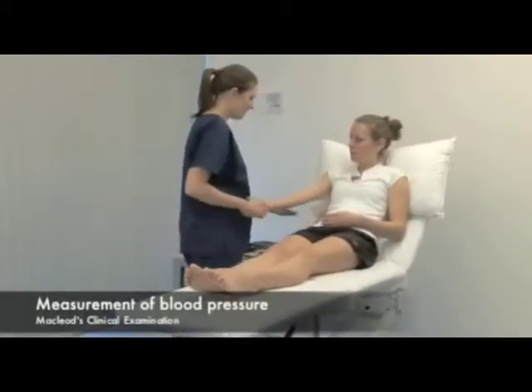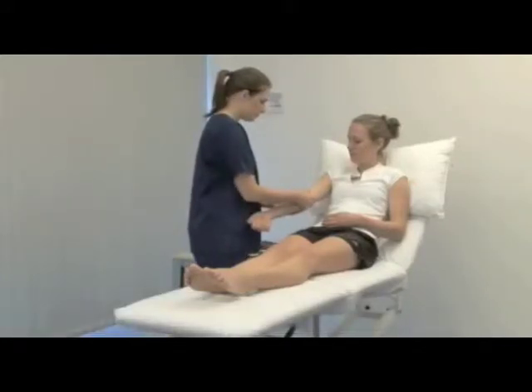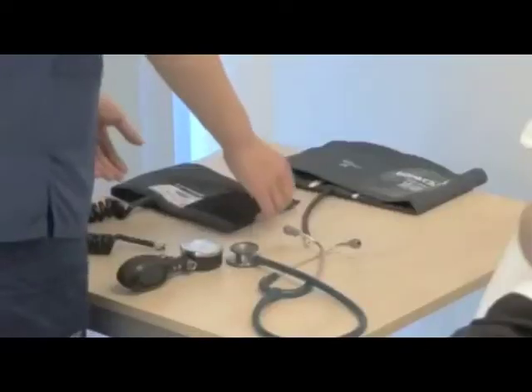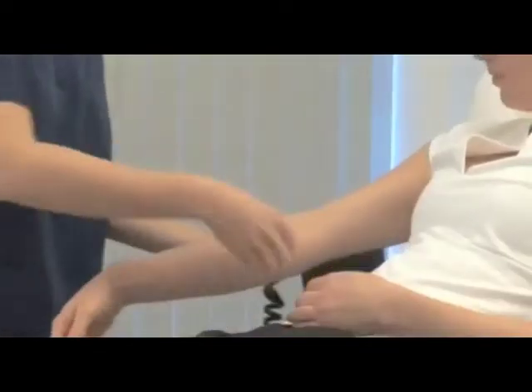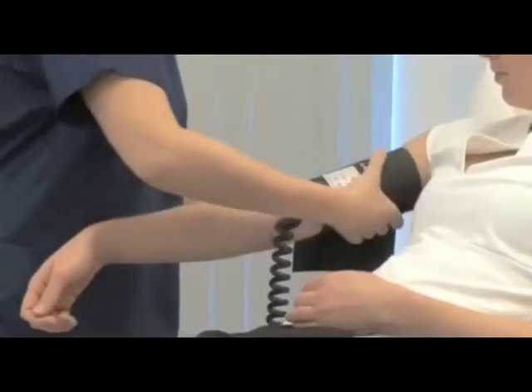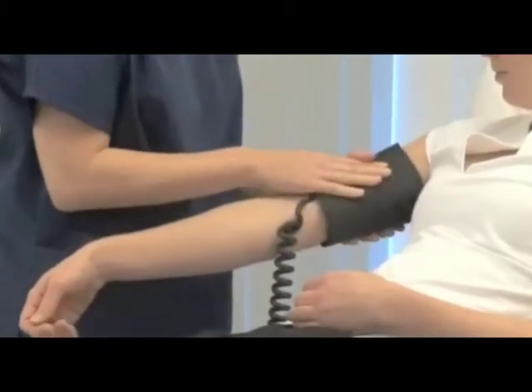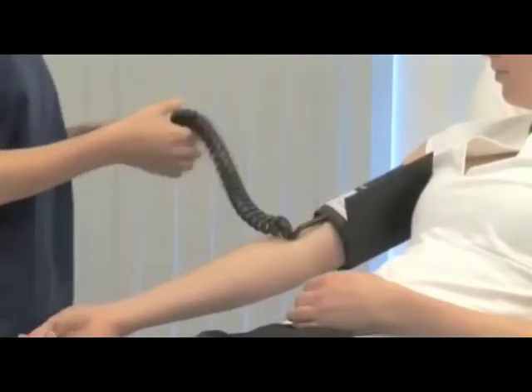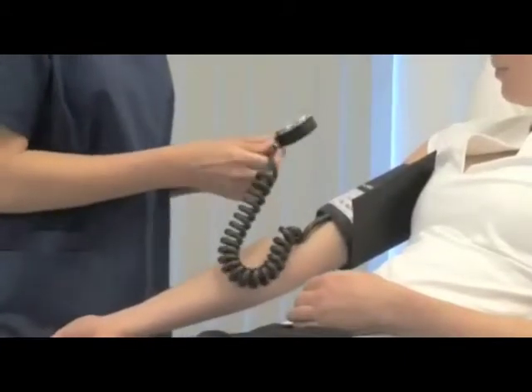All right, guys, watch this patient get her blood pressure taken here. The doctor does a good job of being professional and making sure the patient is comfortable. With the blood pressure cuff, you do feel a little squeeze right here when they wrap it around and start to pump up the blood pressure cuff. Your arm's going to feel a little squeeze, a little pressure, but that's okay. That's normal. All right, so boys and girls, let's watch how this works.